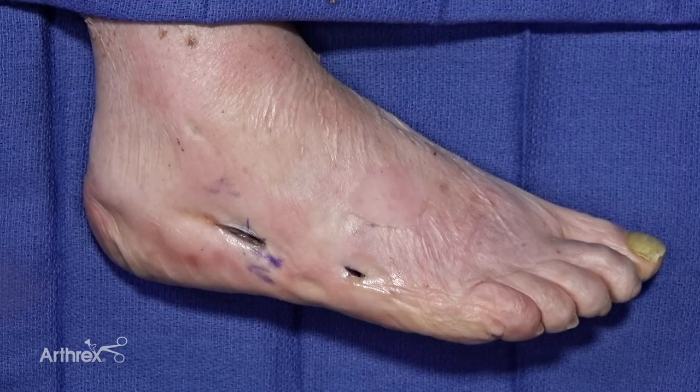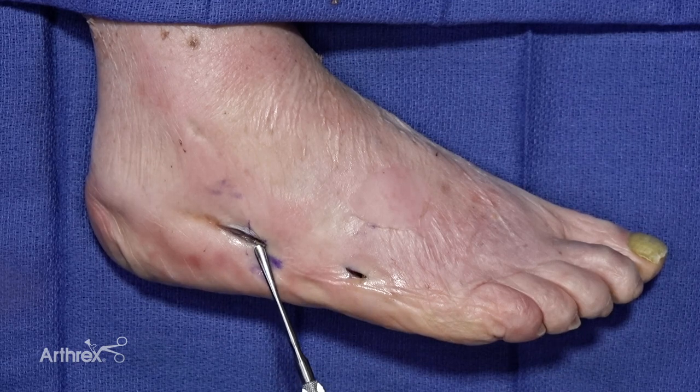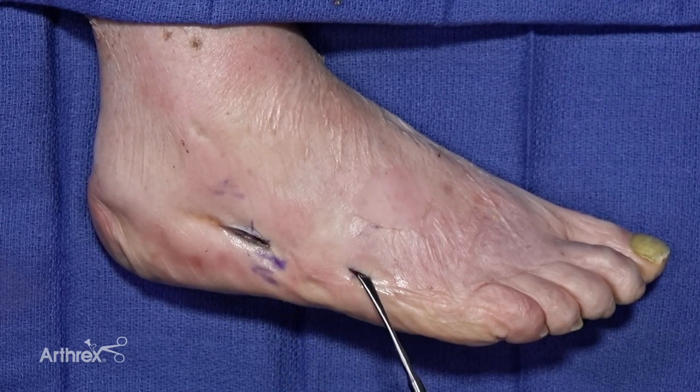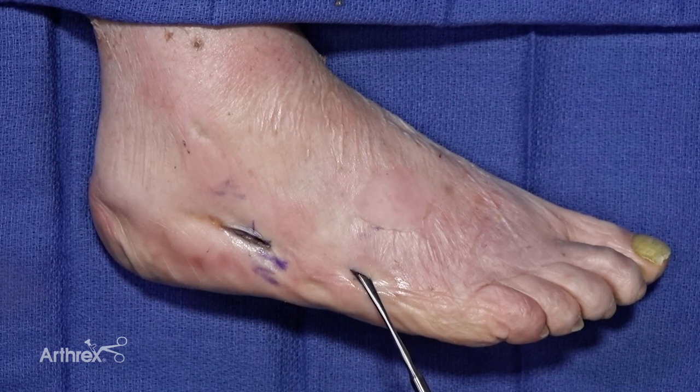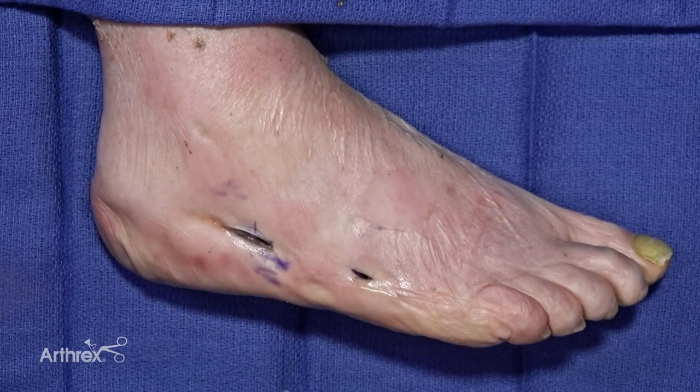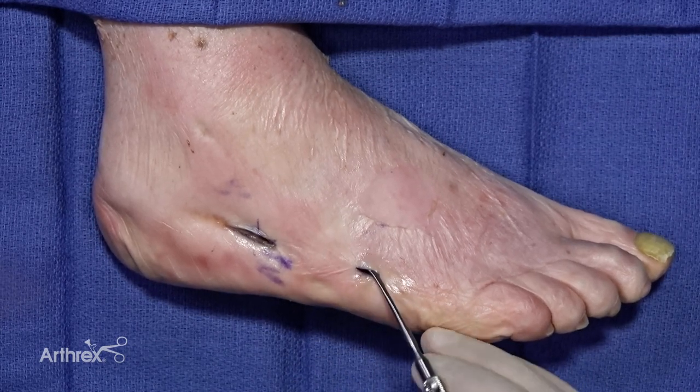We've already prepared where our screw insertion site will be, proximal to the fifth metatarsal base. Under fluoro I will identify the site of the fracture and make a small incision through which you can use a freer to then mobilize the periosteum.